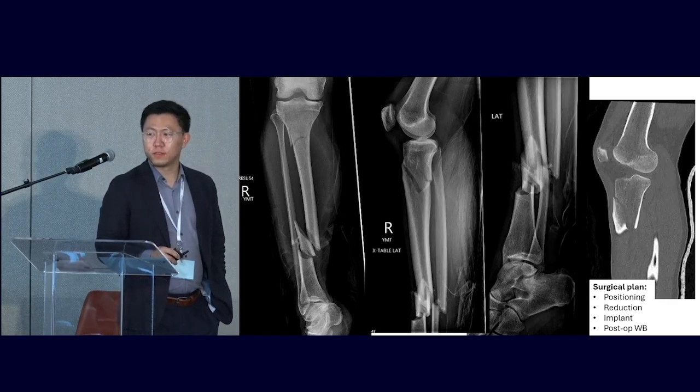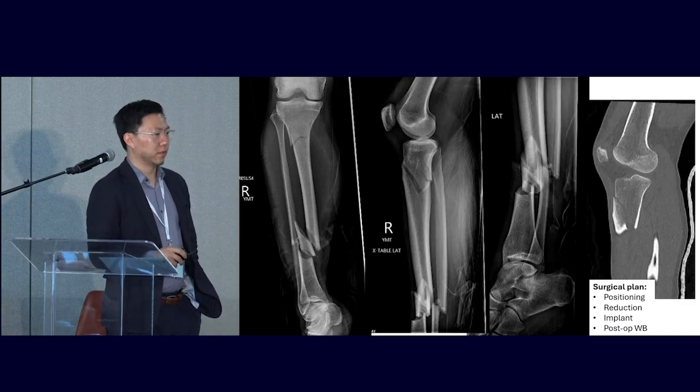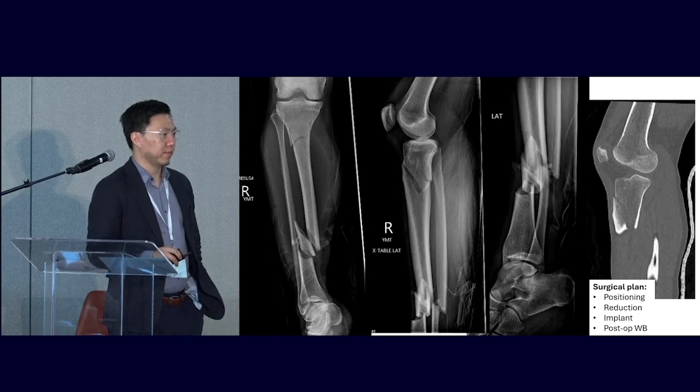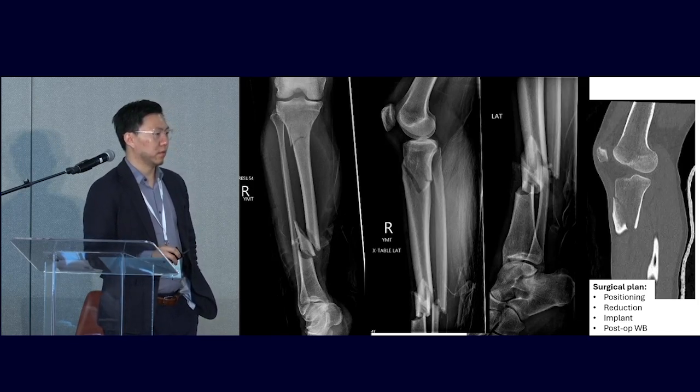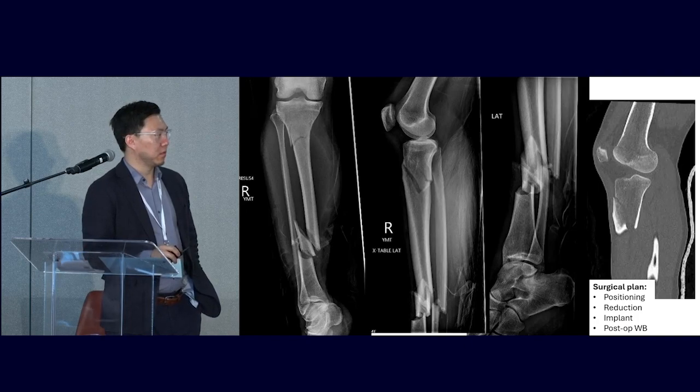Like a big incision there, you want to make sure you do a really good debridement. To me, I just go as big as the hematoma goes. So a lot of times there's a lot more stripping and the hematoma goes further than I think it does. So yes, I usually go bigger than I think I do. But I think any place the hematoma's gone, contamination's gone, so you've got to open it up.